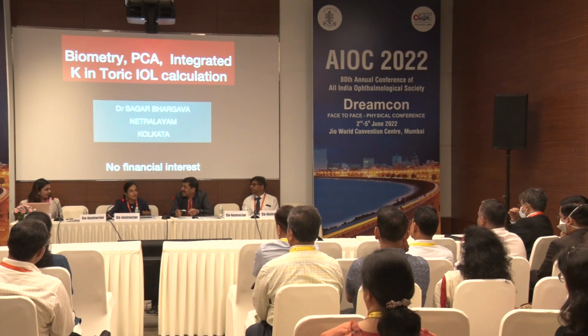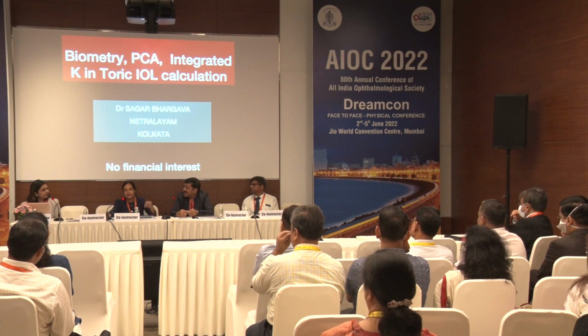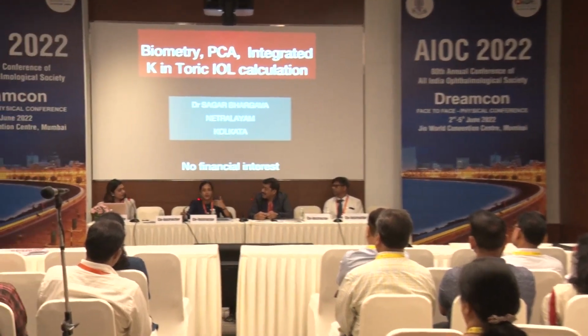Correct. I think both of these were excellent points. One is the second eye status. Like Sir said, if a previously operated eye, especially one operated elsewhere, has a residual cylinder, and this time I can correct that cylinder and give good binocular distance vision, that is a scoring point for the patient. So the second eye status matters, and as Dr. Swati rightly said, what the patient wants.